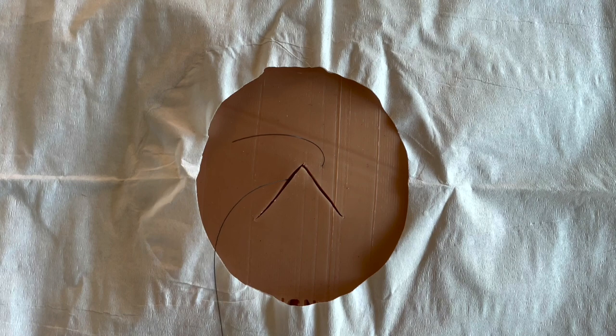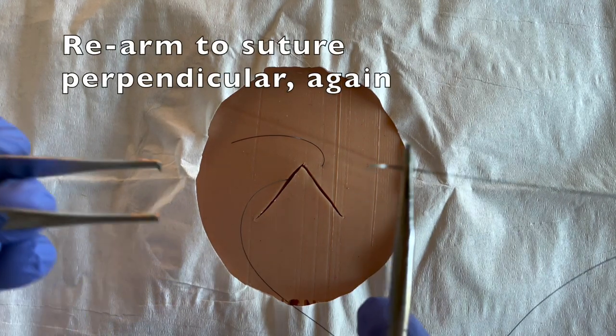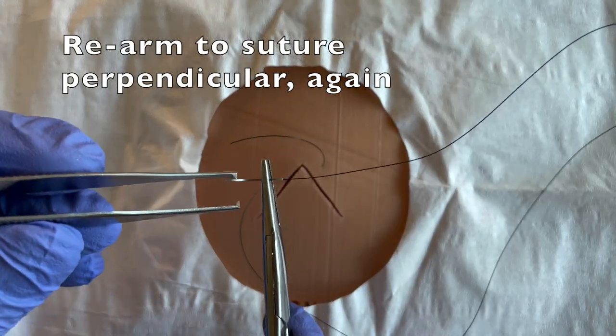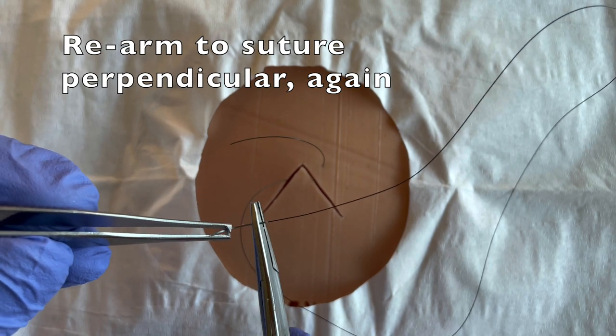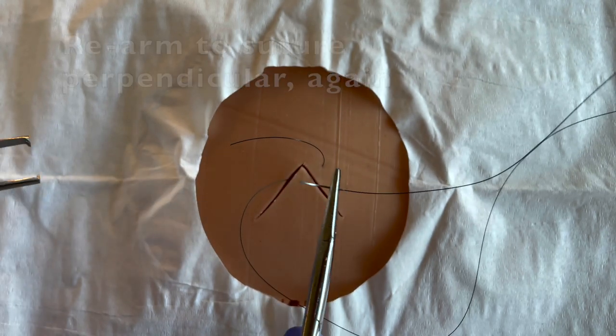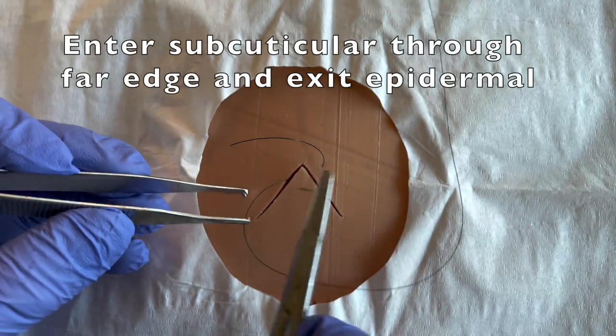When you get to the other end of the wound, you'll again rearm your suture needle, this time back to perpendicular as you did with your very first throw, because now you're going to throw subcuticular to epidermal.